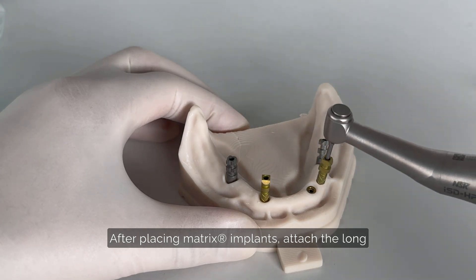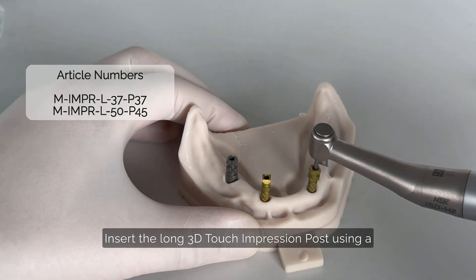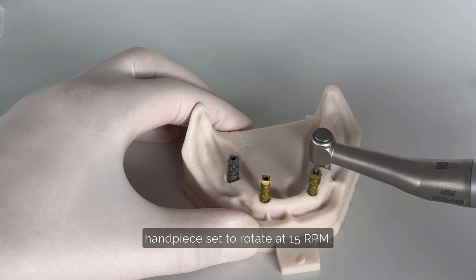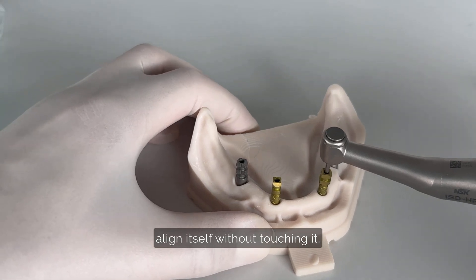After placing matrix implants, attach the long 3D Touch impression post to the implants. Insert the long 3D Touch impression post using a handpiece set to rotate at 15 RPM. Allow the impression post to align itself without touching it.